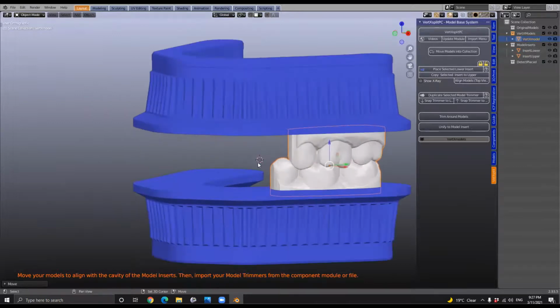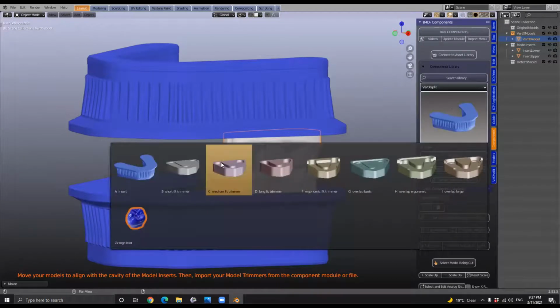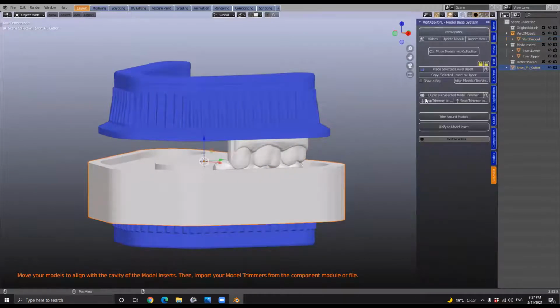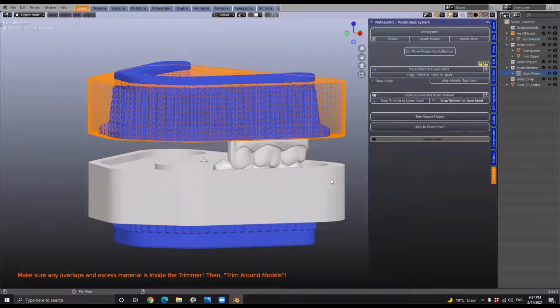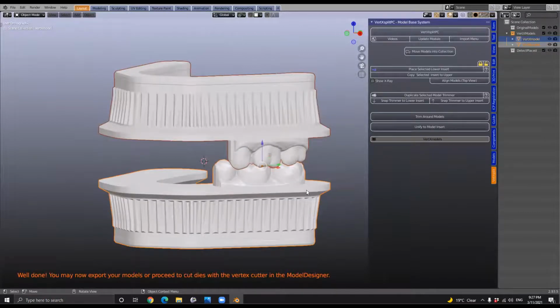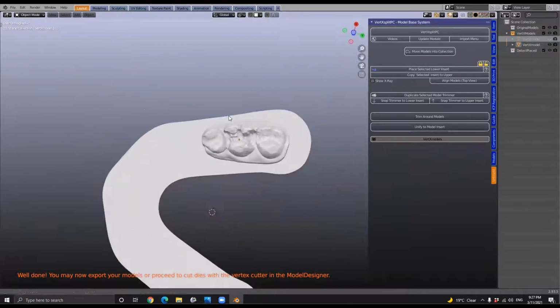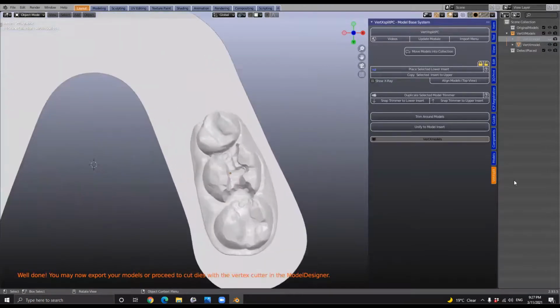And then we're going to bring in our cutters. So back into the component module, cutters. We need 2 of these. So we're going to duplicate it, select that one, and then snap it to the upper, and snap this one to the lower. Then we're going to trim around these models, and then we're going to unify. Okay, so that's unified. Of course, we don't want so much of the models. We're going to look at it from the bottom view, and we're going to trim this out as well.